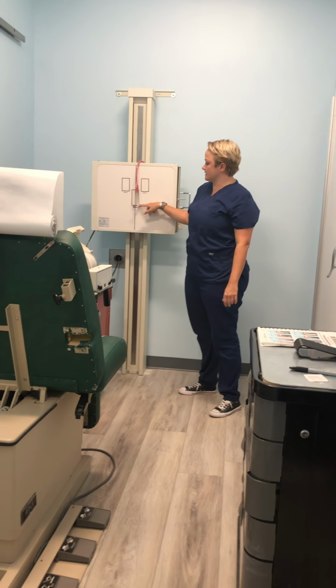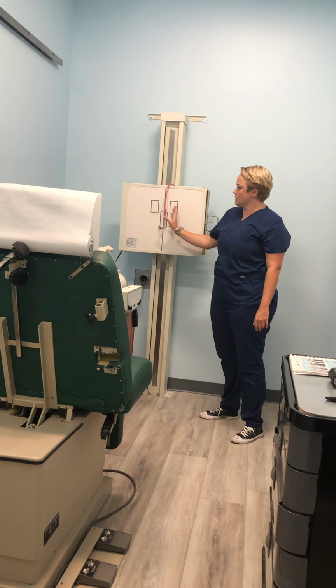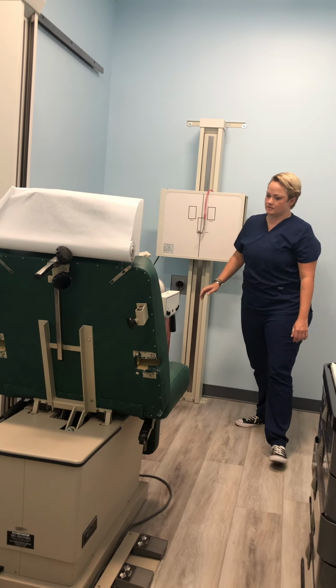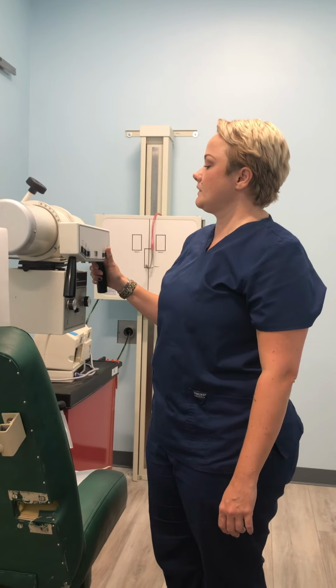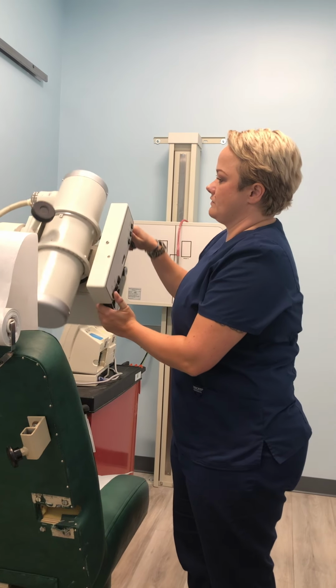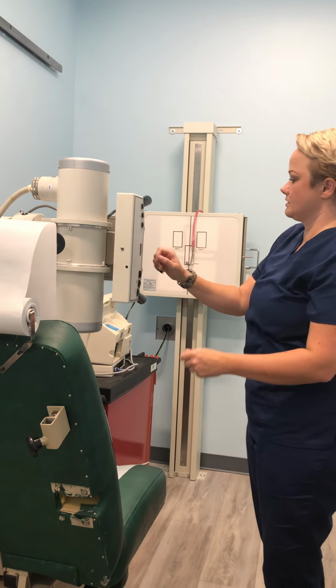Also, those 3 boxes that I was showing on the console correlate with these fields as well. So we're gonna shoot our patient here. That's a chest x-ray, and then we're going to go ahead and position our tubing at 72, because that's what we use for chest. And then go ahead and we're gonna turn on our light.